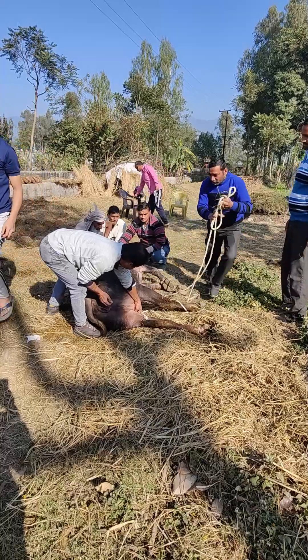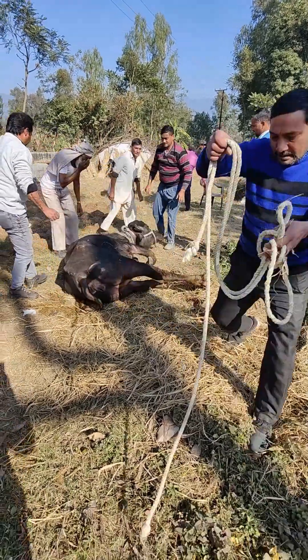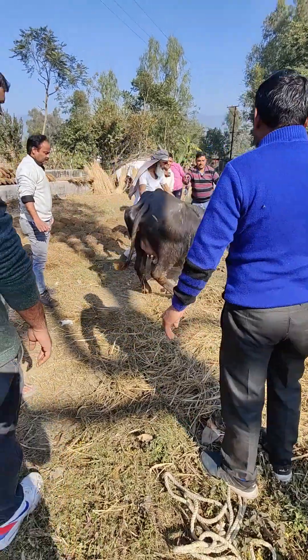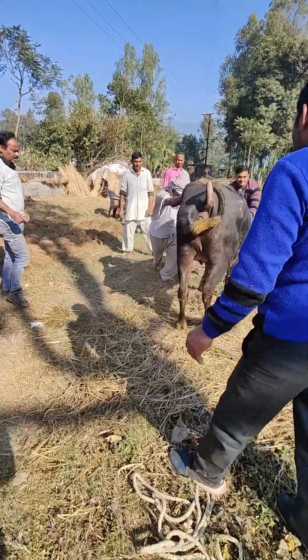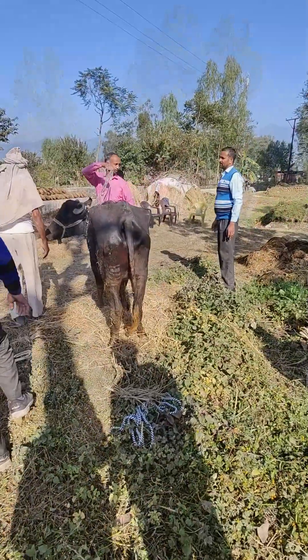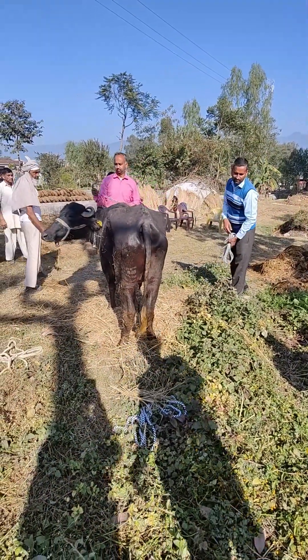After the procedure, the animal stood up and walked without showing any sign of lameness or discomfort, thus giving a feeling of relief to the animal as well as the farmer.